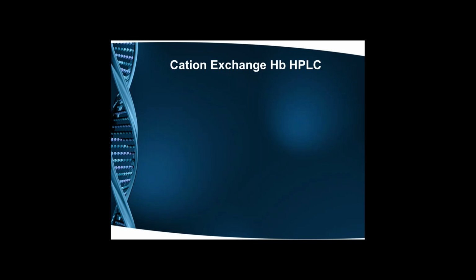Now coming to the main topic of today, that is the HPLC, high pressure liquid chromatography. We could also say high performance liquid chromatography because it gives good results. And I jokingly call this highly paying liquid chromatography because it gives you very, very satisfying results. The most common method that is being used worldwide is the cation exchange hemoglobin HPLC. Next slide.